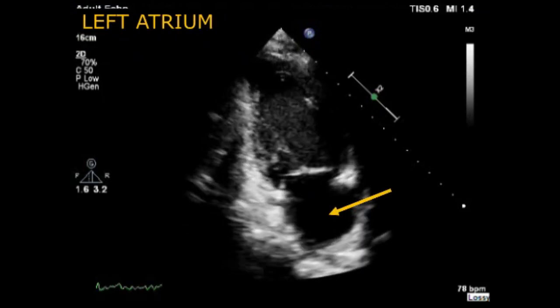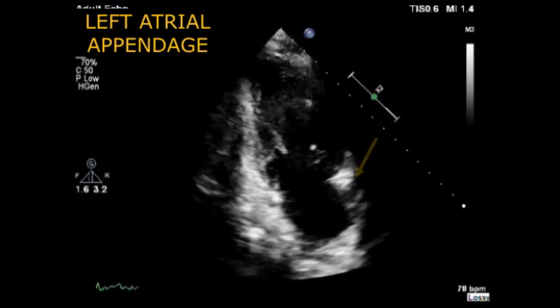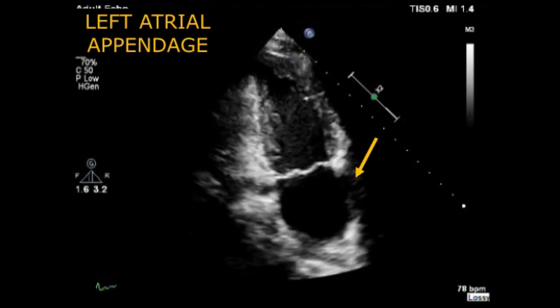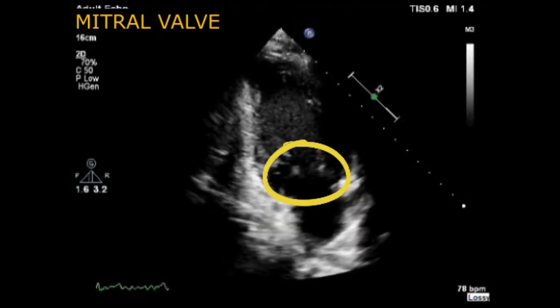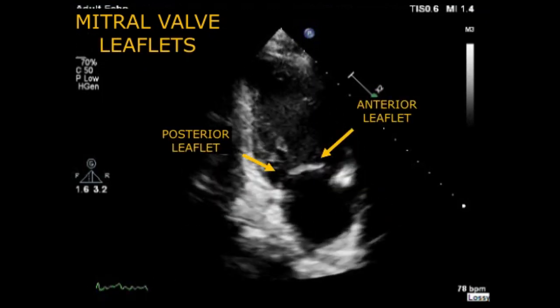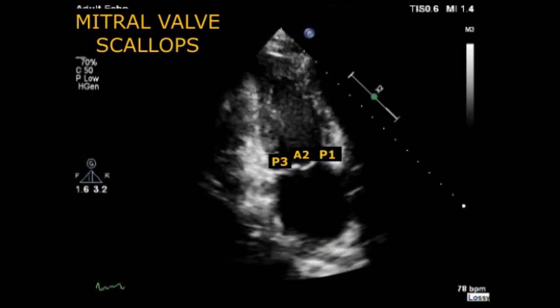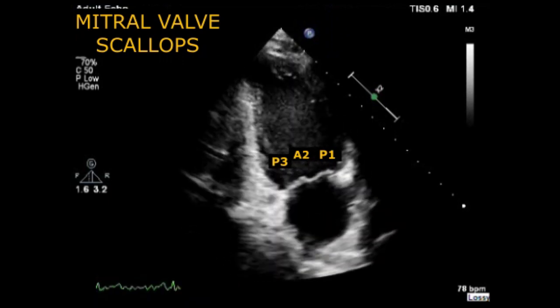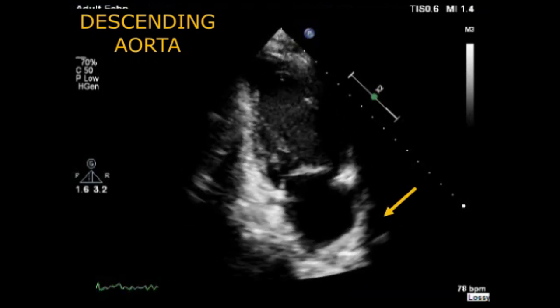Under the left ventricle we have the left atrium, and next to the left atrium you can find the left atrial appendage. The only valve visualized in this view is the mitral valve. We can assess the different mitral valve leaflets — anterior and posterior — and the different mitral valve scallops. From left to right: P3, A2, and P1. And sometimes you can see the descending aorta.